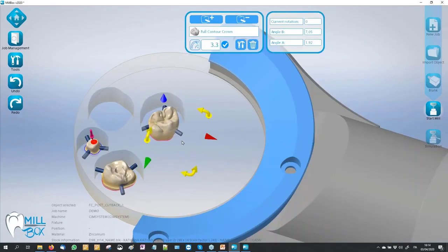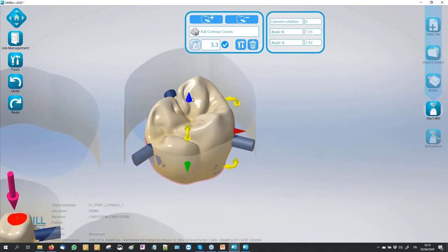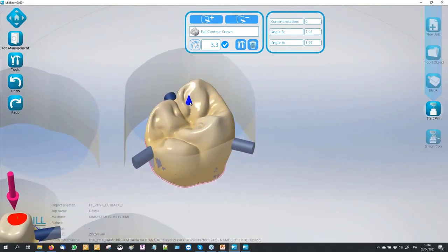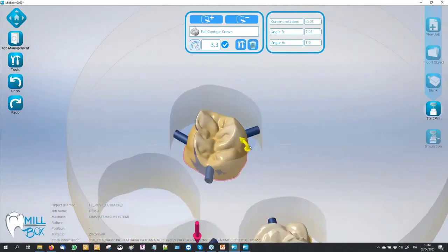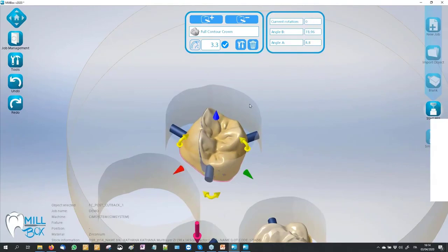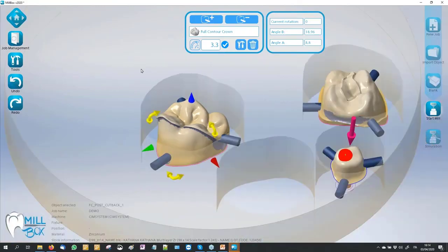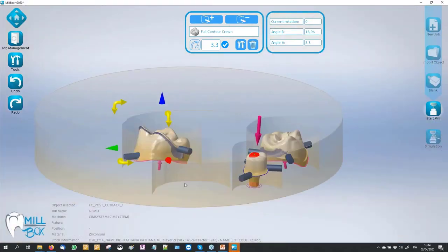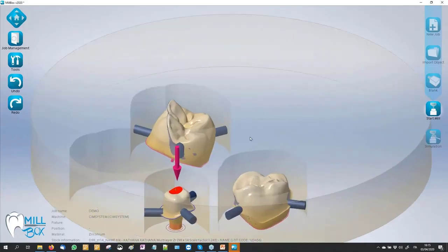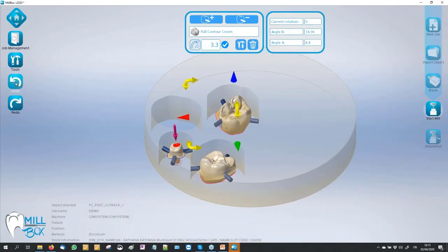We go to look just a bit at this job. Here we select a multi-layer stock, and it's very useful for a dental technician to look directly on our STL at the changing of the colors. In this way they can move and rotate the STL file to find the right best position to have a good result after the milling process. This is something that in the previous version of the software was not possible.